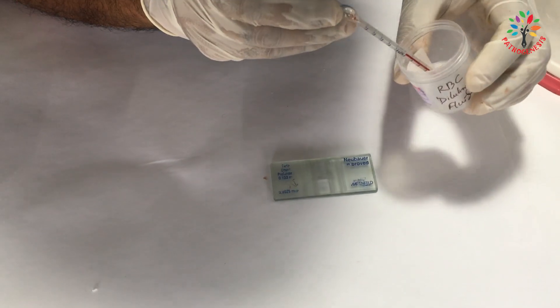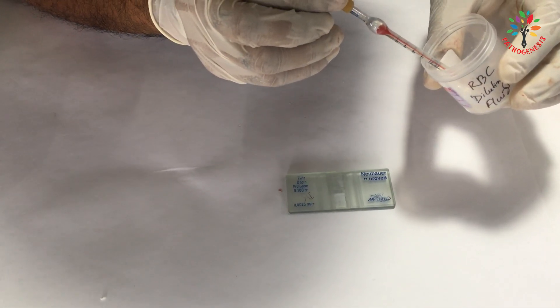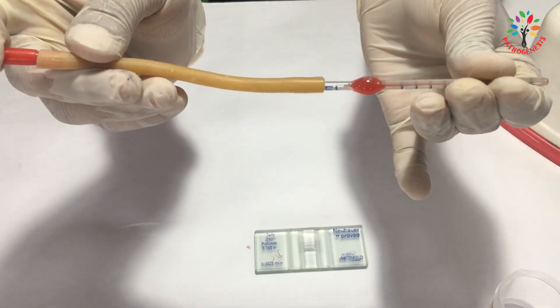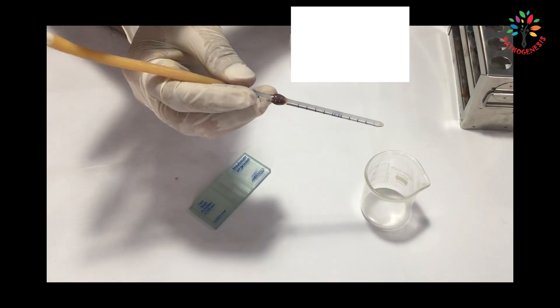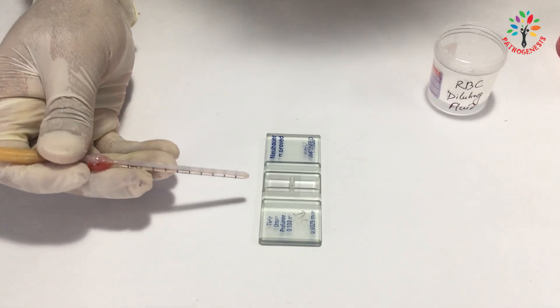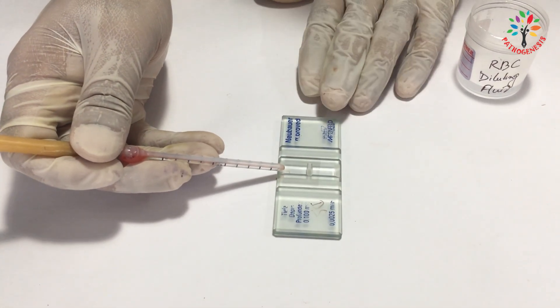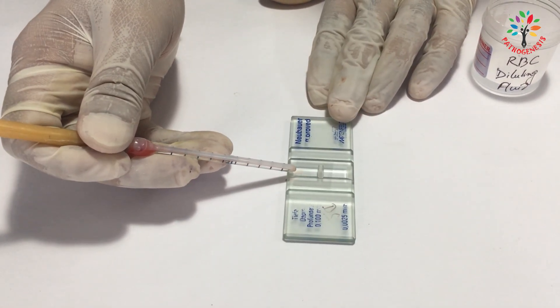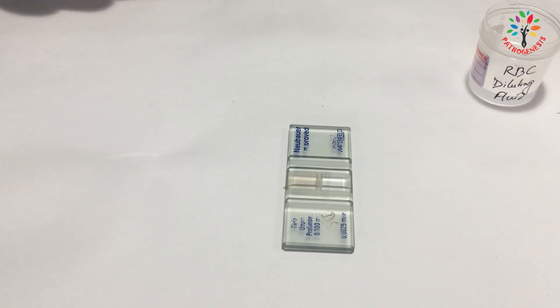Then draw RBC diluting fluid up to the 101 mark of the pipette, and mix the blood and diluting fluid properly by rolling the pipette horizontally for 1–2 minutes to ensure even distribution. Discard the first few drops, then charge the Nuber's Chamber by transferring a drop of the mixture under the coverslip. Be careful to ensure the chamber is not overcharged — just enough to fill under the coverslip. Wait 1–2 minutes to let the cells settle.